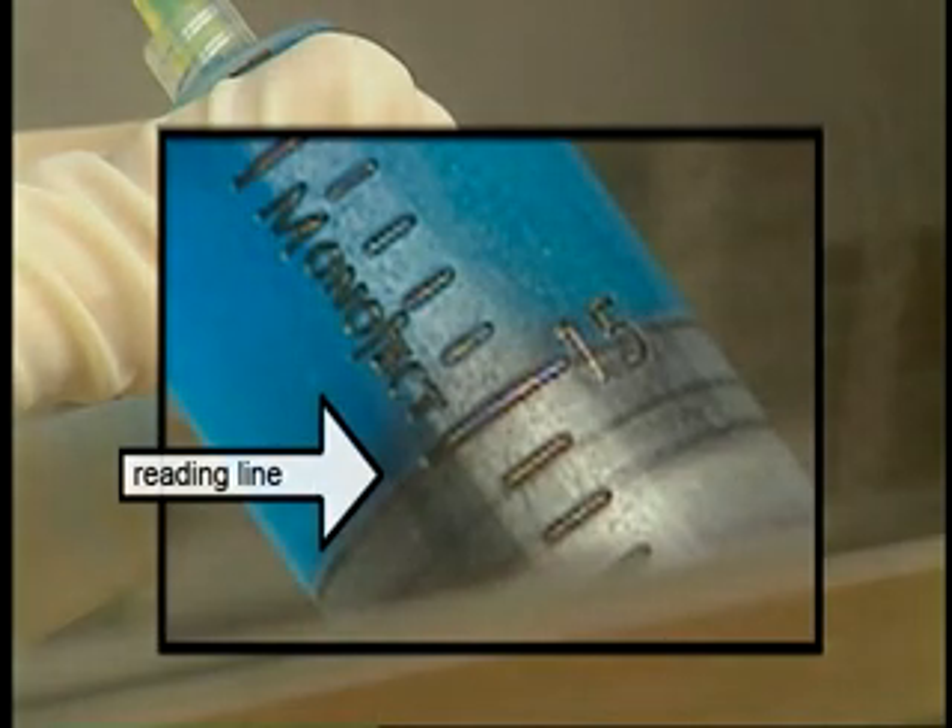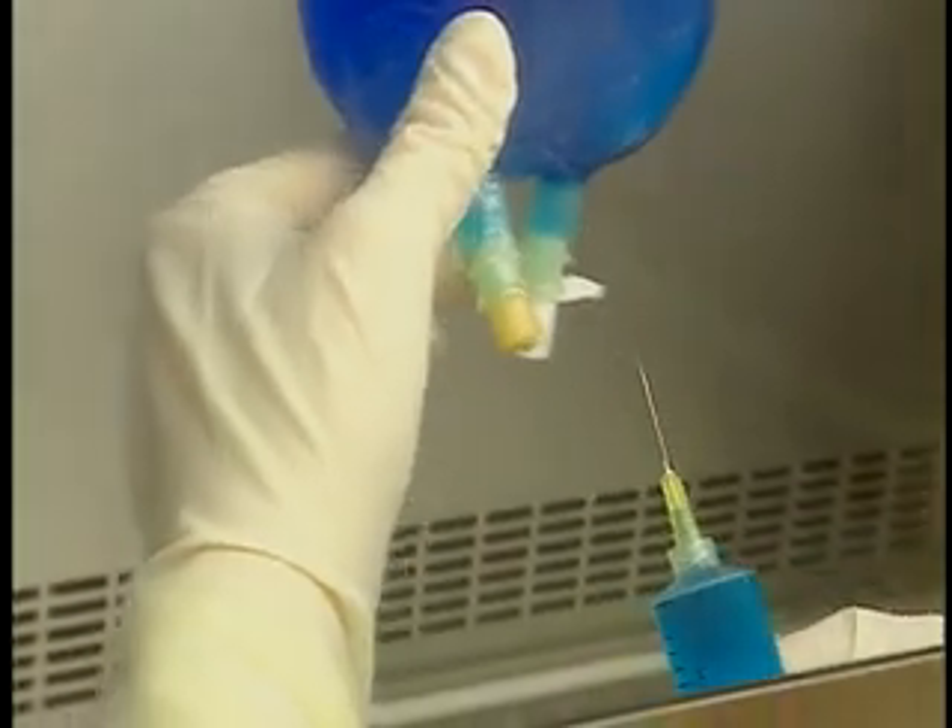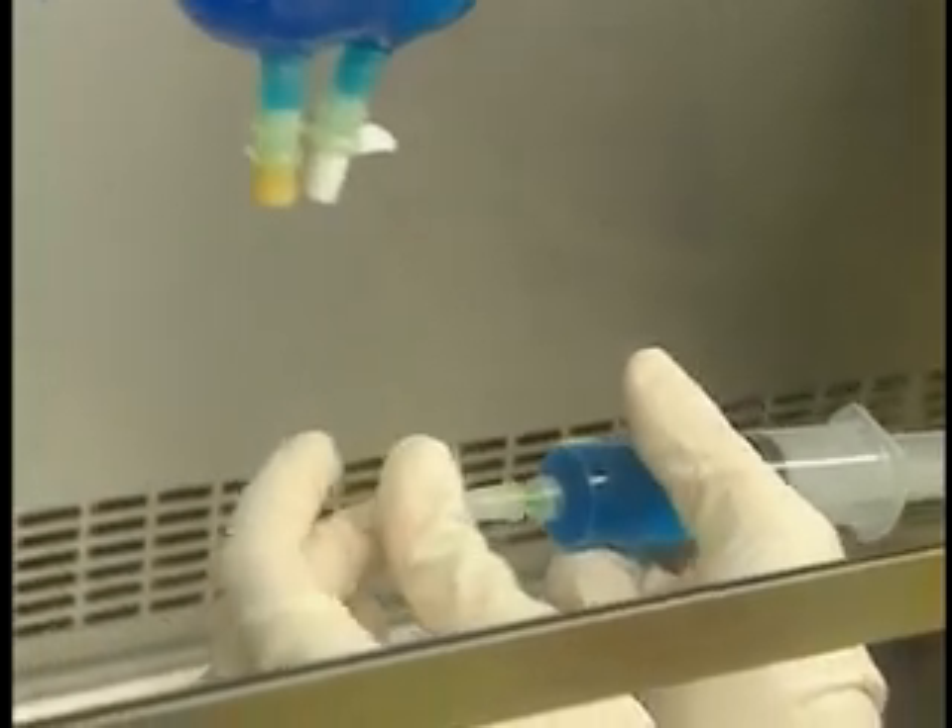Bring the syringe back to a 70 degree position and withdraw the needle. Cap the needle and perform verifications as required by facility protocols.